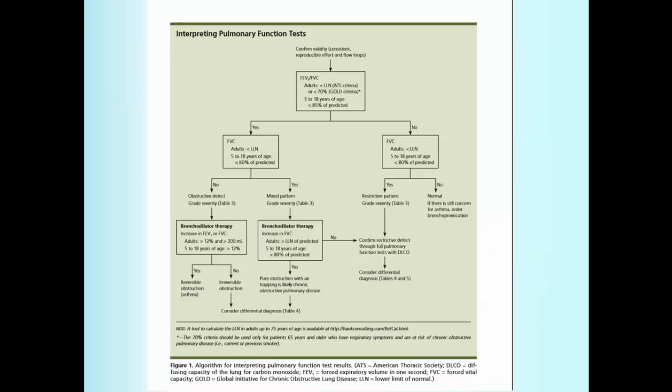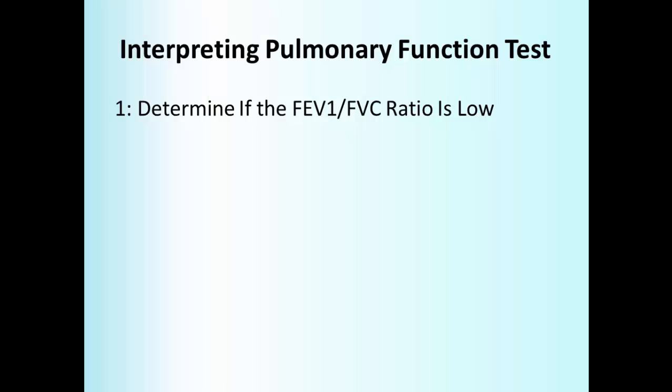This here is a stepwise approach to interpreting the pulmonary function test and to determine whether there's a need for further testing, and how to use the pulmonary function test to formulate differential diagnoses. So we're going to talk now about interpreting the pulmonary function test. We're going to talk about it in steps.